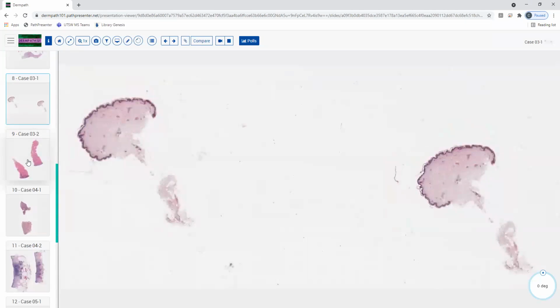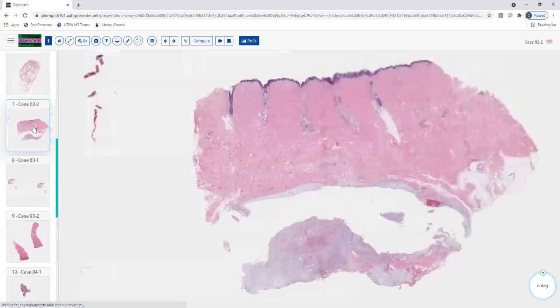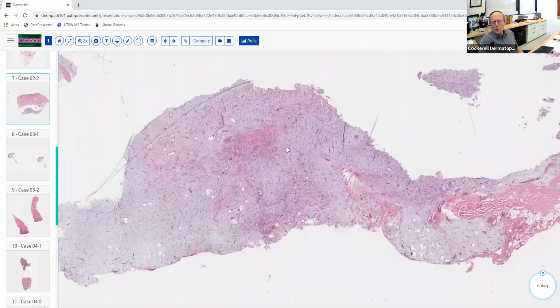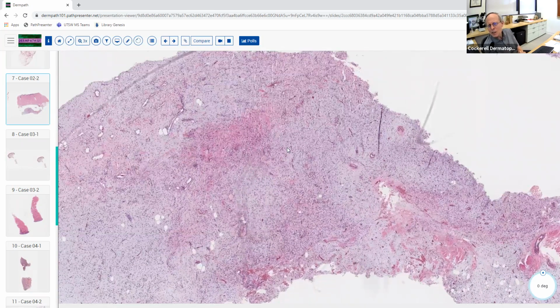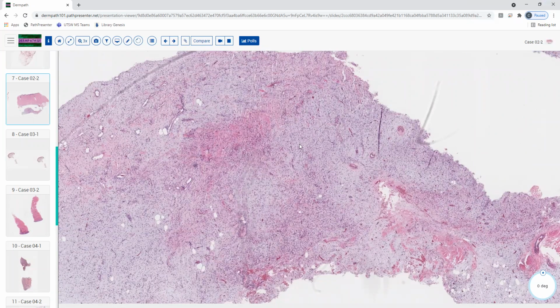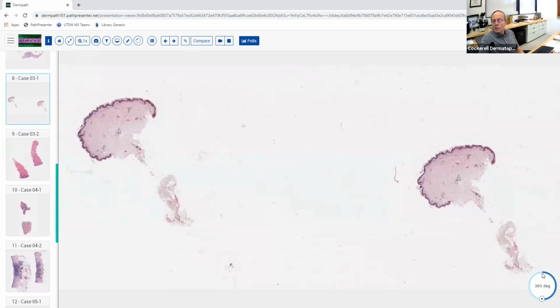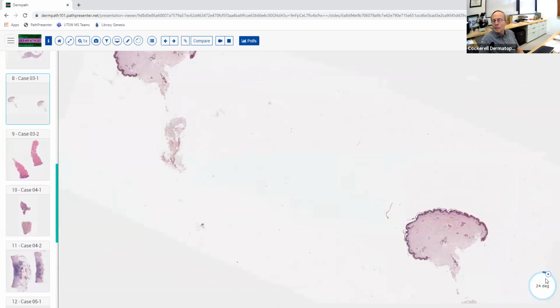This one looks kind of tissue culture looking, like a nodular fasciitis. You really need more cellularity for nodular fasciitis, I think, and some more inflammation. This is really just more mucin here. Okay. So I think that would favor that. Okay, now we're going to some different type of stuff here. This is more inflammatory skin disease.